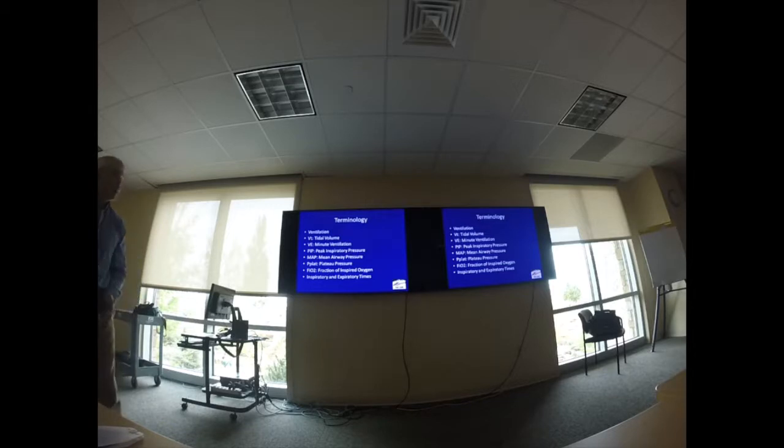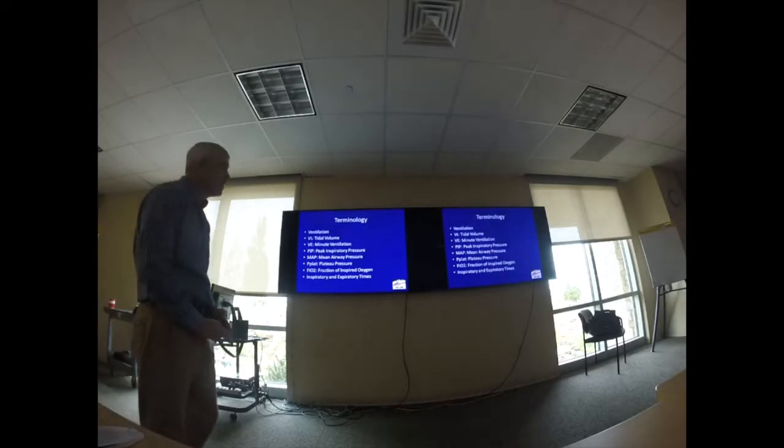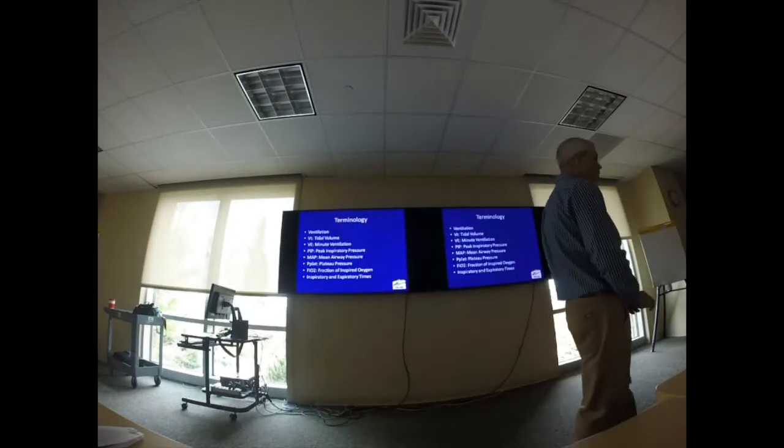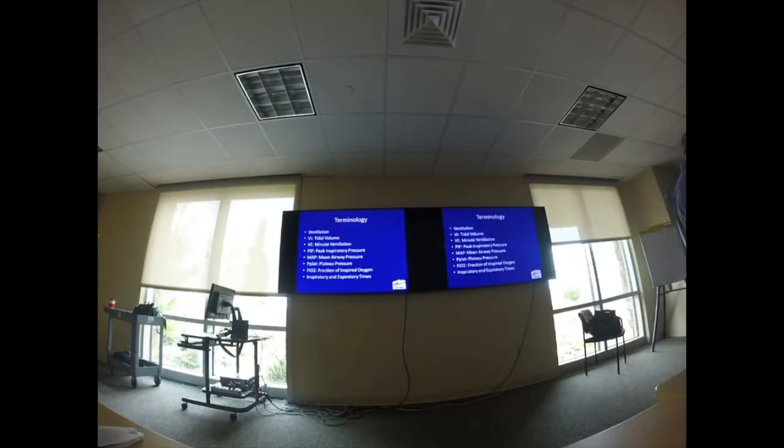But what I will talk about a lot is all this terminology, and we're going to do some of it individually, but let's run through some of it closely. So ventilation is just the act of moving air into and out of the lungs, right? It's not something that we're going to talk a whole lot about. That's obviously what we're going to do for this, but other than that, it's not super technical.